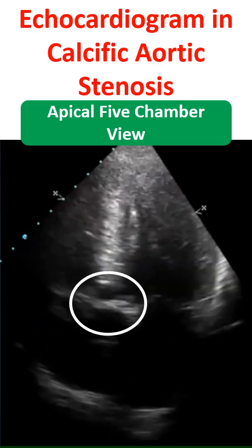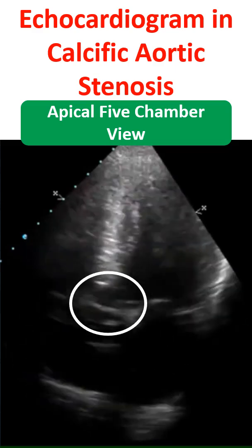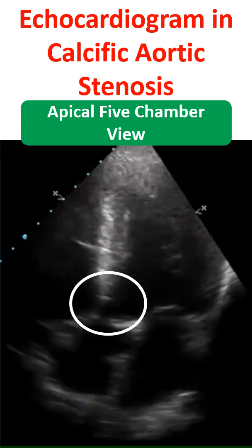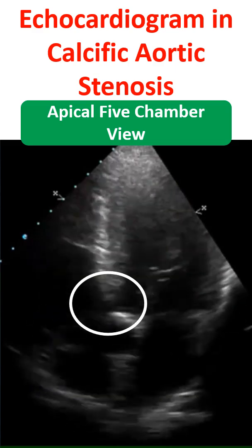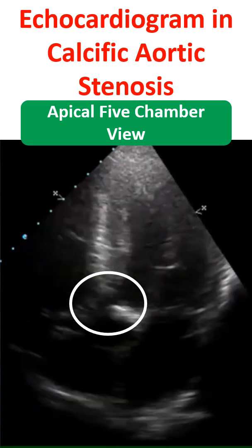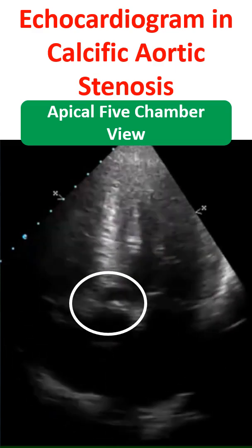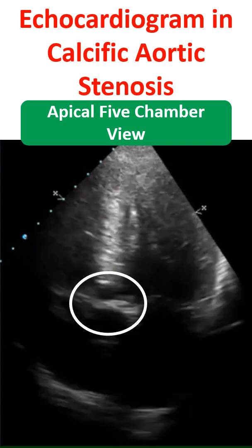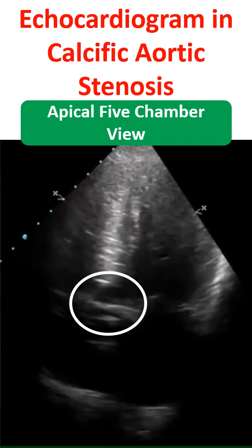Another view used for estimating the gradient is the suprasternal view, especially when associated mitral regurgitation gets picked up by the Doppler beam, giving a falsely high gradient from the apical 5-chamber view.